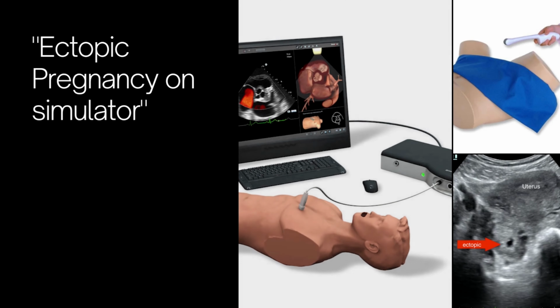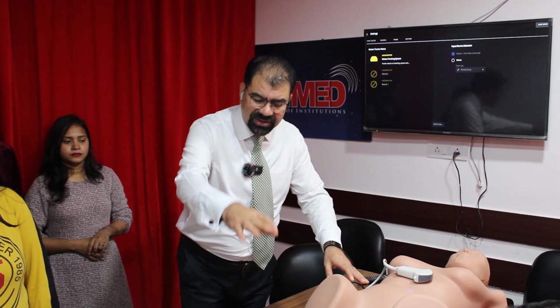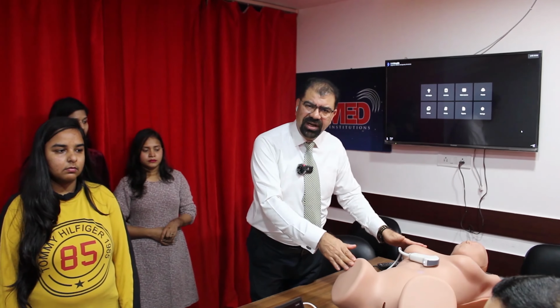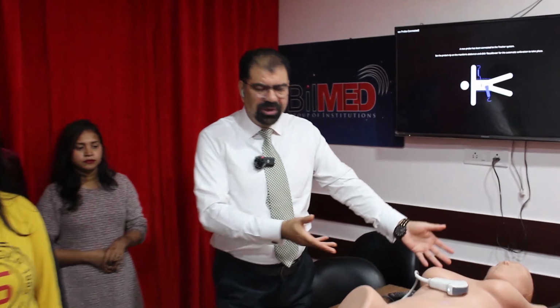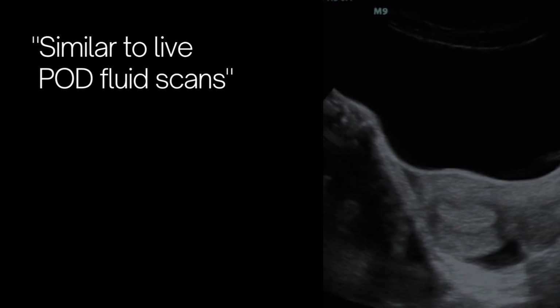Now this simulator will behave like an ectopic pregnancy. If you want an ectopic pregnancy, we will set it. We will set a pathology over here, and this will behave like a real patient with an ectopic. If you don't want to see an ectopic pregnancy, you want to see fluid in the cul-de-sac, we will set the pathology, POD fluid, and how much: mild, moderate or severe. This will behave like a POD fluid.